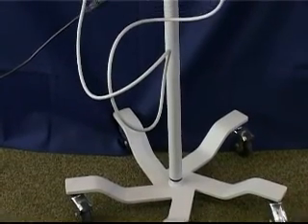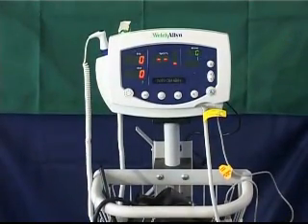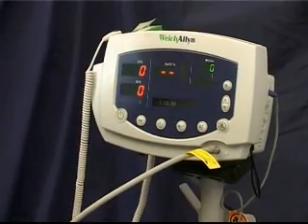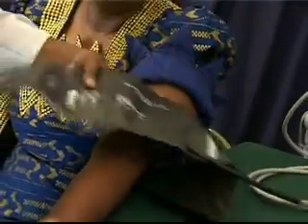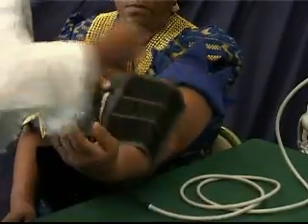When using an electronic blood pressure unit, the basic procedures for ensuring the accuracy of the measurement taken remain exactly the same. Seat the patient quietly and comfortably for at least five minutes prior to the reading being taken, then use the left upper arm and select the correct size cuff.